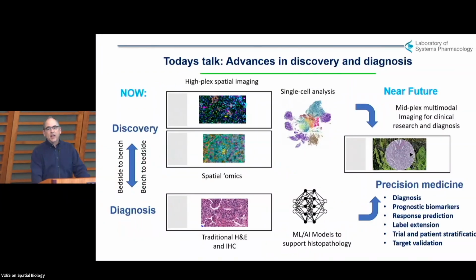So what I'm going to talk about today is really two aspects of this problem. One of them has to do with discovery, and that's where we see 3D initially playing the role. It's self-evident, I think, to all of us that medical imaging, which typically means radiological imaging, PET, CT, et cetera, are inherently 3D, tomographic methods. But in clinical practice, essentially all data is collected from 5-micron thick tissue sections. They're occasionally frozen, particularly intraoperatively, but primarily they're formaldehyde fixed, paraffin embedded, as most of you will have encountered, so-called FFPE specimens. They're cut 5 microns thick, and then they're imaged.